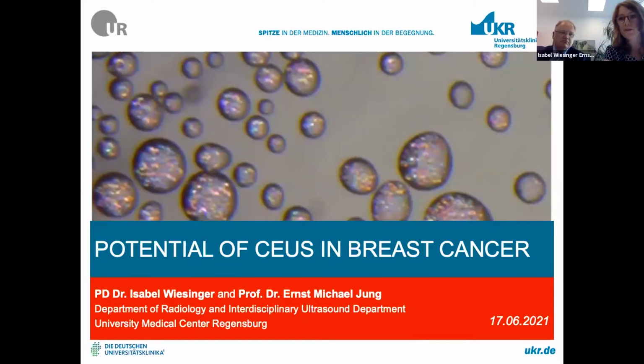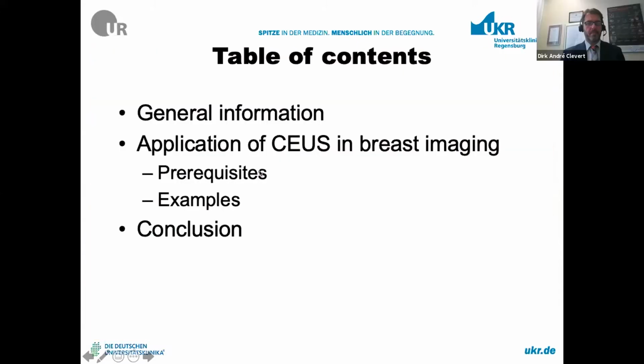Today we are going to talk about contrast-enhanced ultrasound in breast imaging. We will start with general information, then a bit more specifically about breast imaging with the prerequisites, followed by imaging examples and a conclusion in the end.